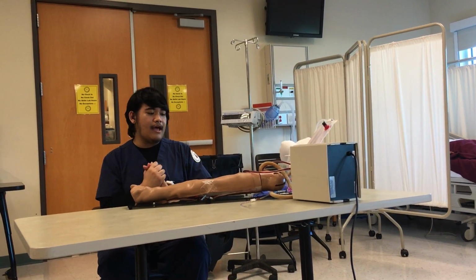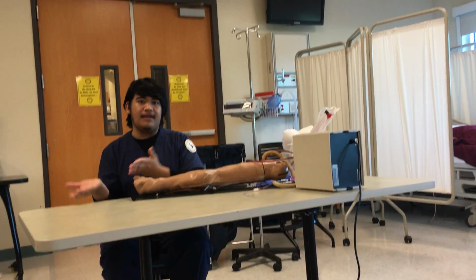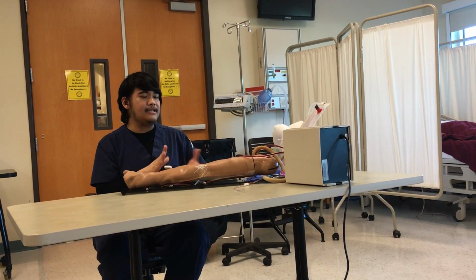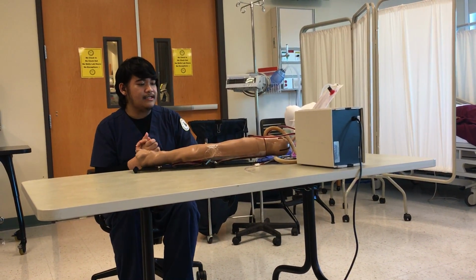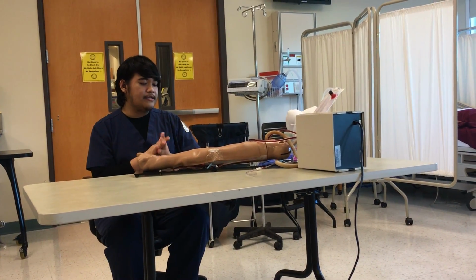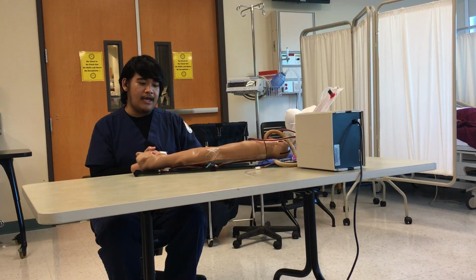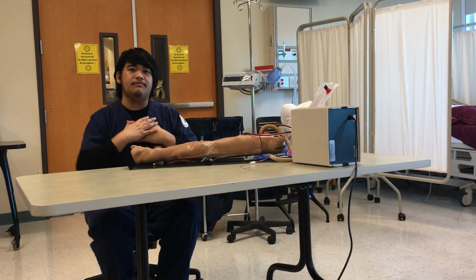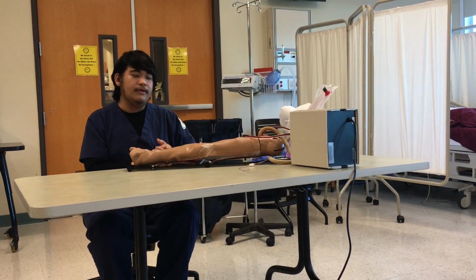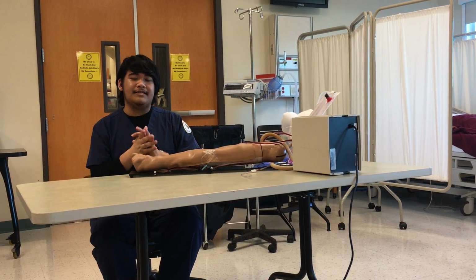After that, I would explain to the patient and to the family member what this test is for. We are doing an ABG test, and this is basically going to let us know how well your lungs are functioning, and it will also help us modify a care plan for you. Once I've explained that, I would explain the risks.